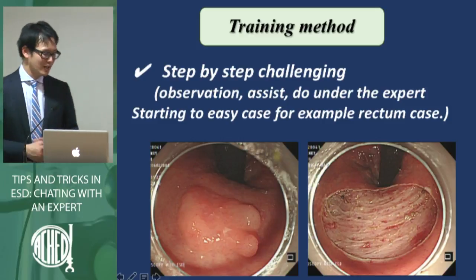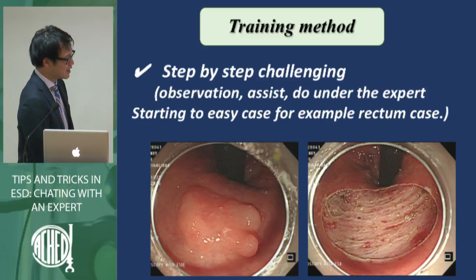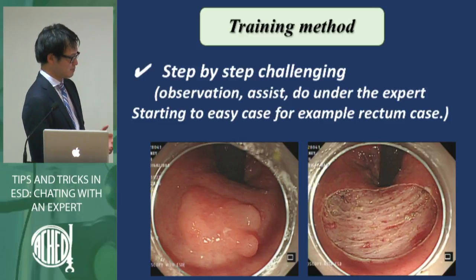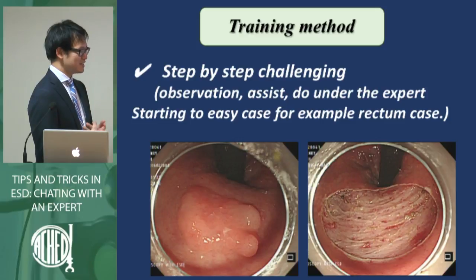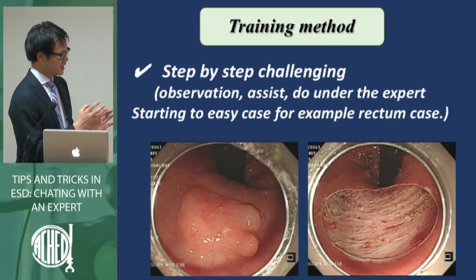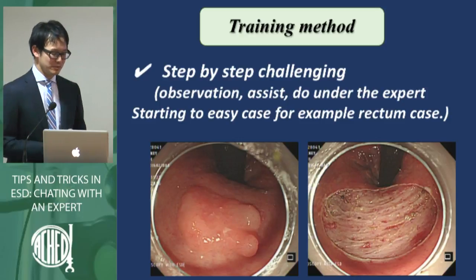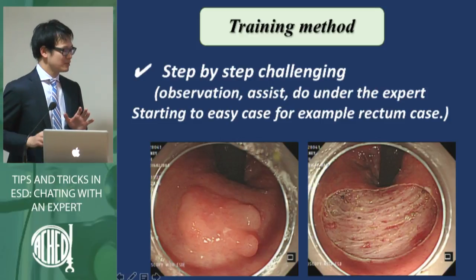This case is from when I lived in the Philippines. Philippine doctors completely resected this region. If they start with easy cases, I think they can resect by ESD procedures. I think these cases were completed under an expert. I usually suggest how to cut, talking to the Philippine doctors. It's important to have an expert.